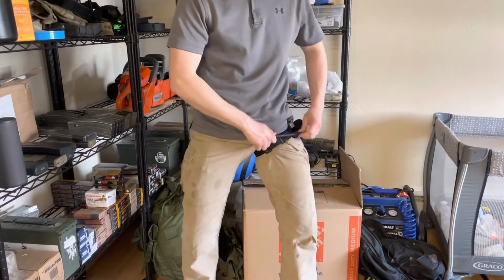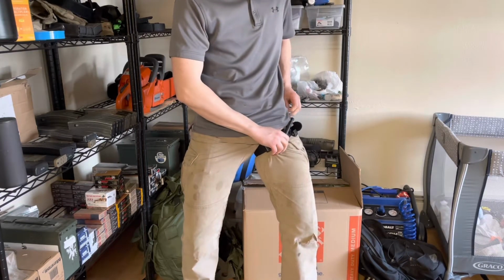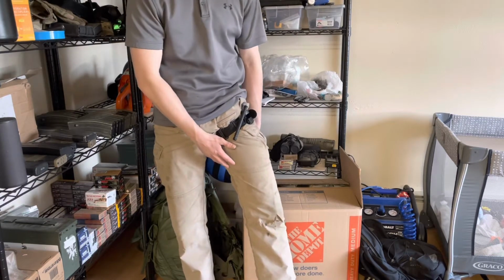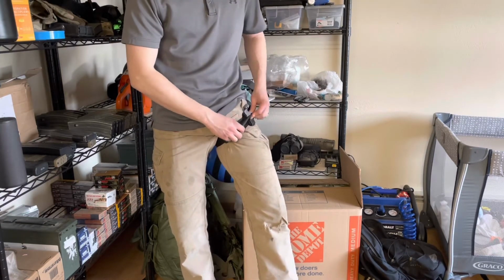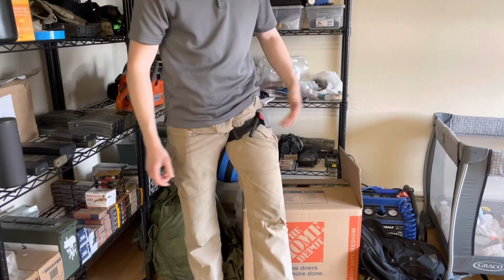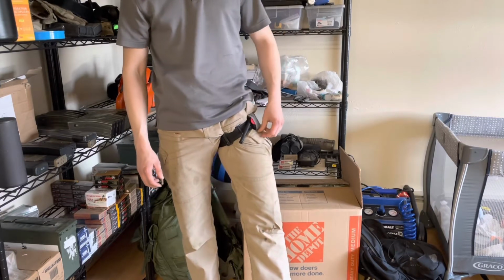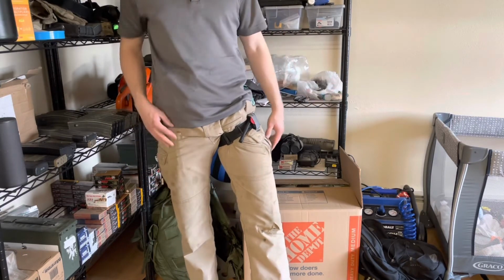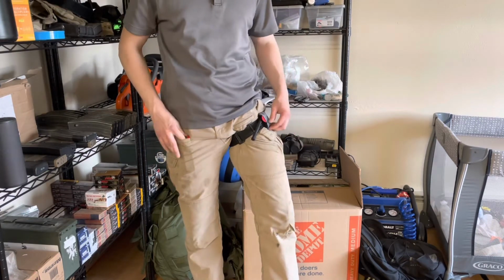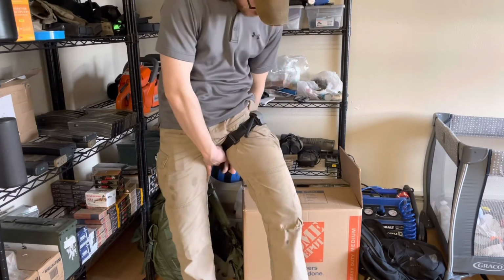and then start going in to twisting your windlass, all right? Once you get your windlass tight and you get your artery occluded, you know the artery is occluded when you stop the blood loss coming out of the leg. Go ahead and secure that windlass, secure your strap, and secure your windlass strap security device right here. And then I'll put your time down with a Sharpie or something, right at the time that you apply the tourniquet. So that's pretty much that.